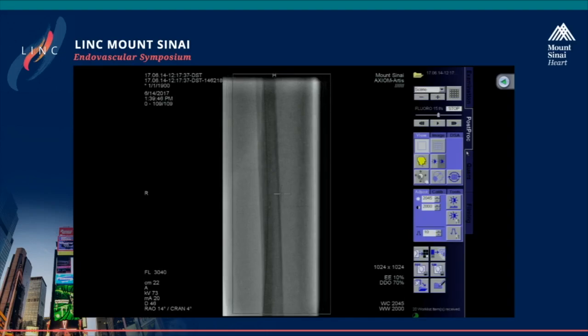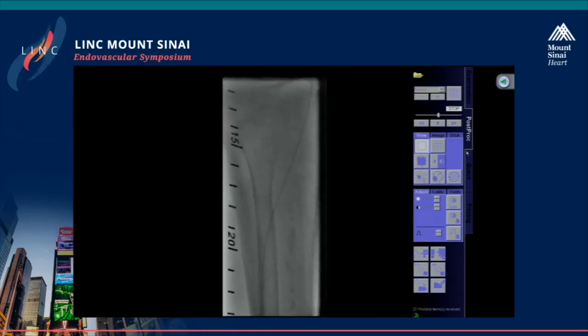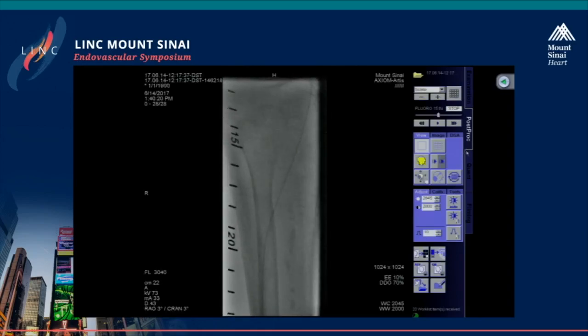So, Dirk, now we've just exchanged the trailblazer down, and I think, as Andre always says, just a second. Can you switch on the microphone for Marian? Okay. So I would have classified that in our trial as a bullfrog case because there is no calcium there. It's a long lesion. I think it would be nice to inject dexamethasone. So I think that would, in our mind, be an ideal candidate for what Stephen has mentioned. And we do not have, as we are discussing, the final solution right now.